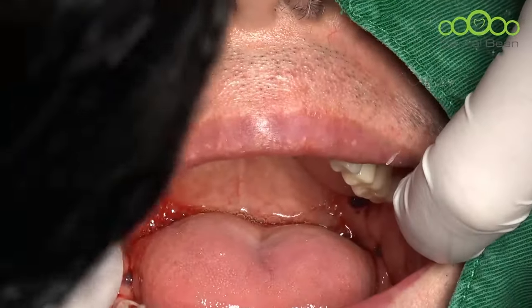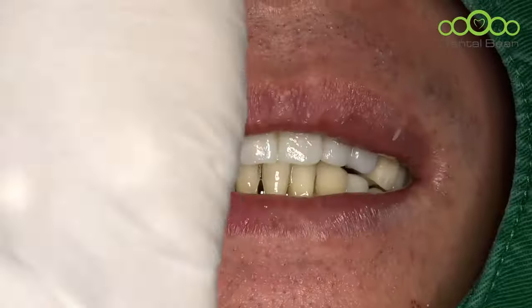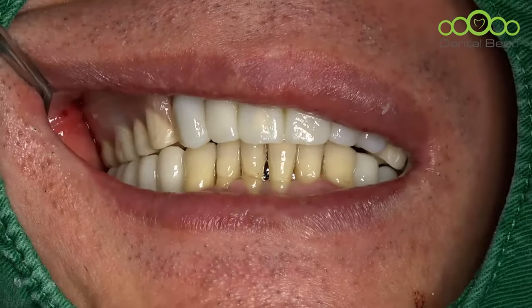Okay, good. And please close your mouth. And then check the occlusion.